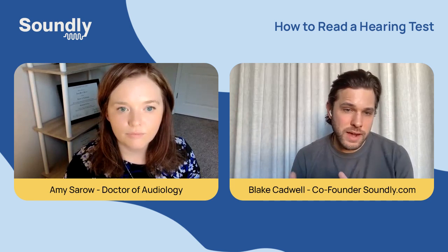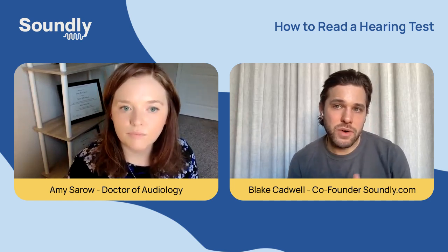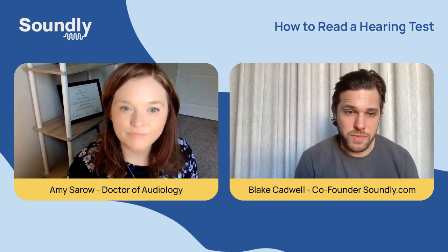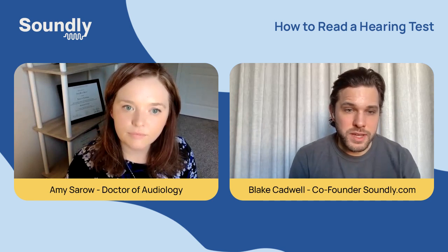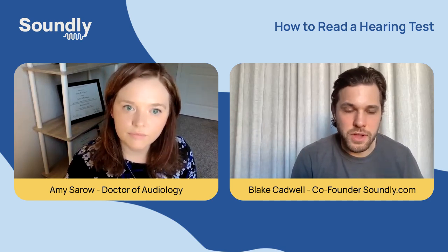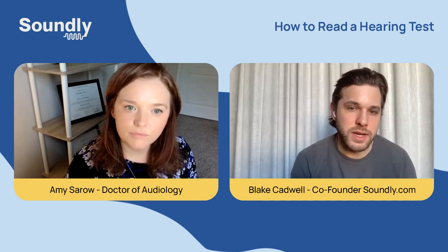So once you have this information from this chart, can you talk to us about how an audiologist would use the information? Of course, we have a screener on Soundly.com. It is a screener only and meant to just give you a sense for your hearing loss. But if you took a hearing test in a clinic, how would that information then be used to treat your hearing loss?